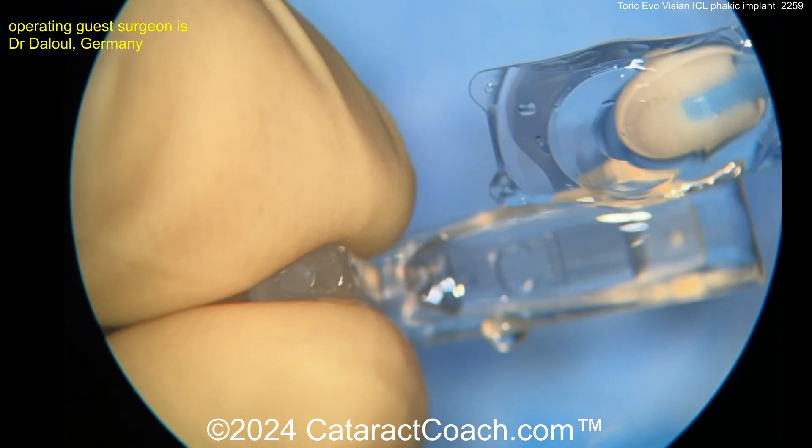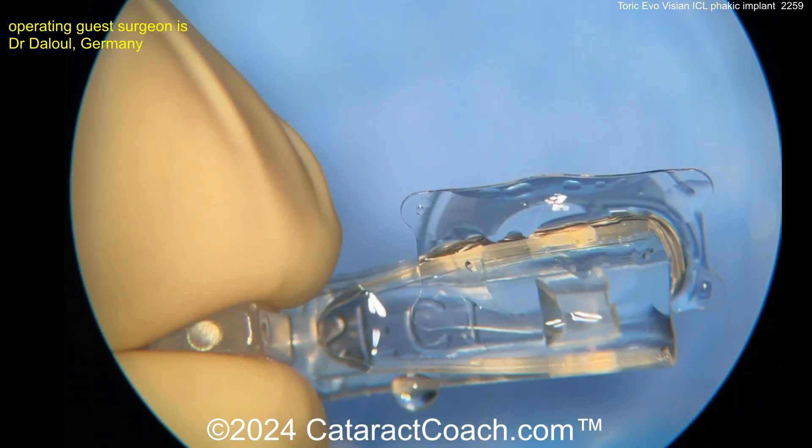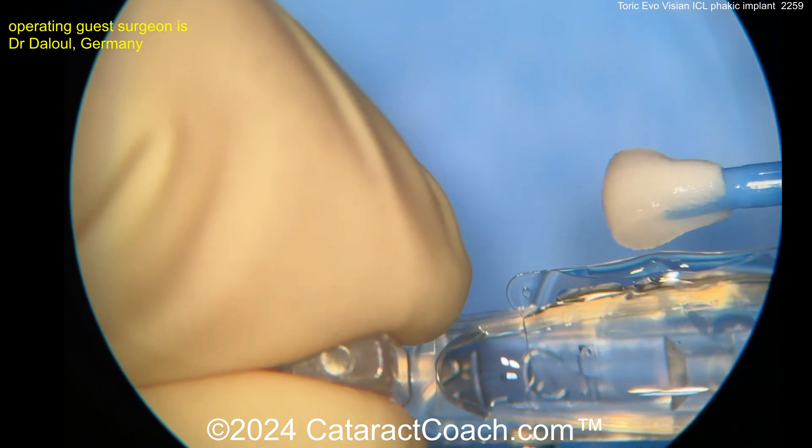Here's loading of the lens. The lens is made of a collagen material. It's very, very thin, very delicate, and so you have to load it in a very particular way.